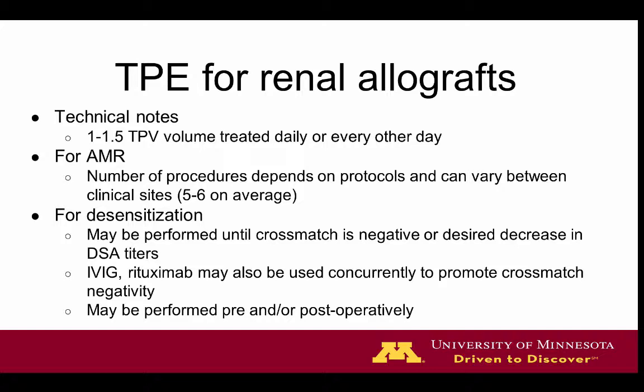So some of the more technical aspects of TPE is that 1 to 1.5 total plasma volume exchange is recommended daily or every other day. Whether the patient is receiving the procedure for TPE or for desensitization further determines how many procedures you do. On average, for antibody-mediated rejection, 5 to 6 is performed.